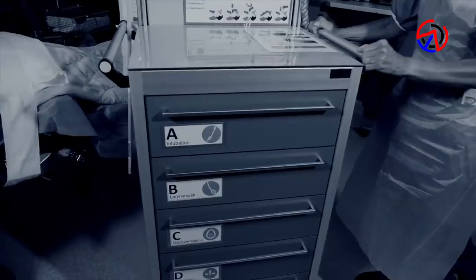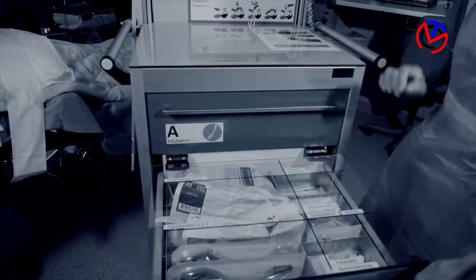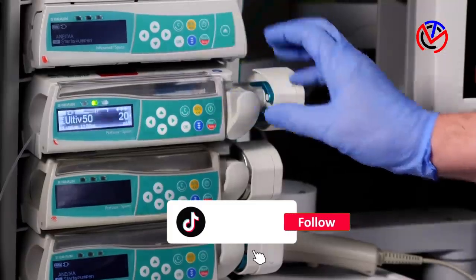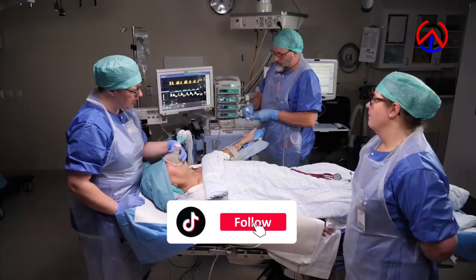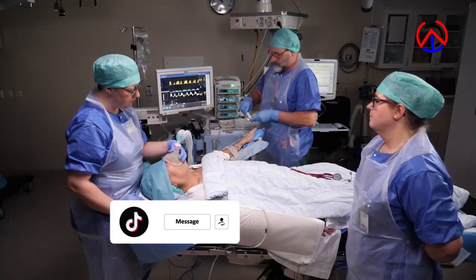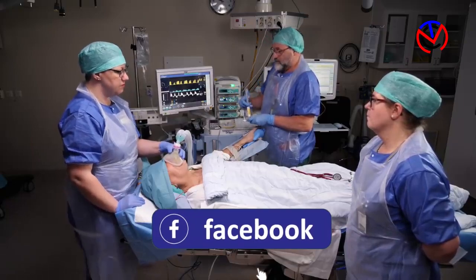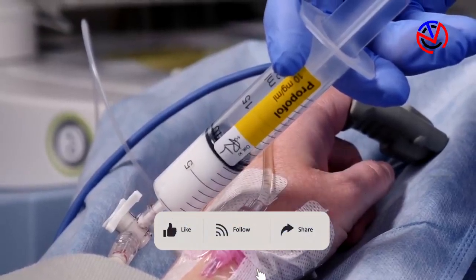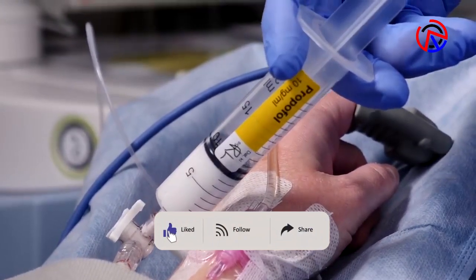Administer the analgesic and wait for the onset. Laryngoscopy is very painful and requires drugs to alleviate sympathetic response and airway reflexes. Next, administer the hypnotic. The patient gradually loses consciousness, airway muscle tone, and respiratory drive. From this point on, the patient's breathing is your responsibility.